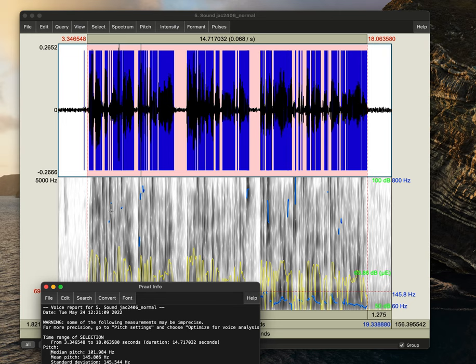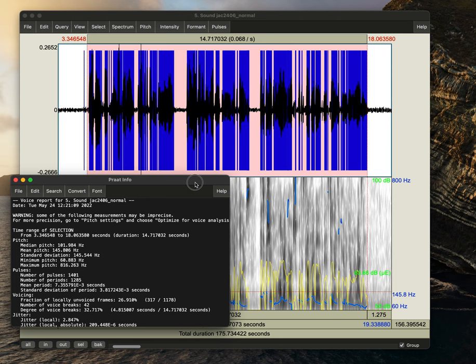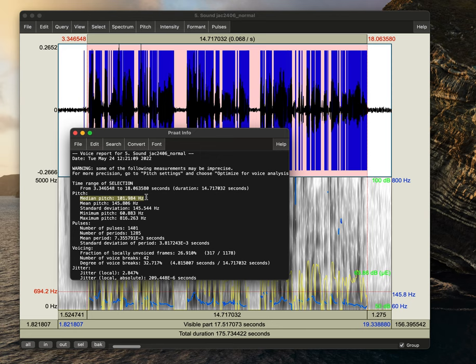I'll be using median pitch since we do see, in fact, that there is lots of noise artifact in the pitches. We see lots of blue really high up that's not indicative of true voicing. And so we want to try to discard that as much as possible. So we'll use the median pitch here, which was around 101 hertz. We also see that the standard deviation was about 145 hertz.